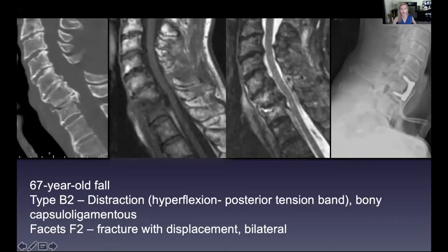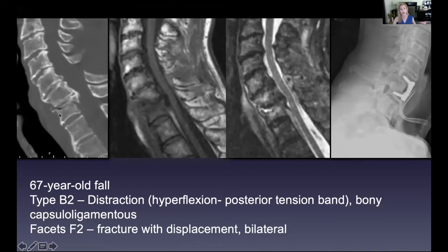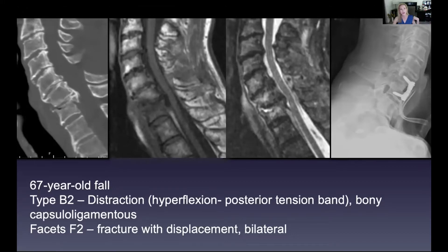This person did not have ankylosing spondylitis or DISH, but end-stage spondylosis — degenerative change — which changes the spine biomechanically into one big lever arm. Even though this didn't look that bad, this is what we believe caused this under-the-end-plate type of fracture. There's a fracture under the end plate, like we've seen on the others, and the top part of the spine slid backwards and compressed the cord.